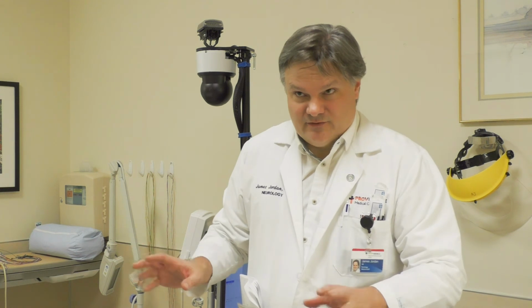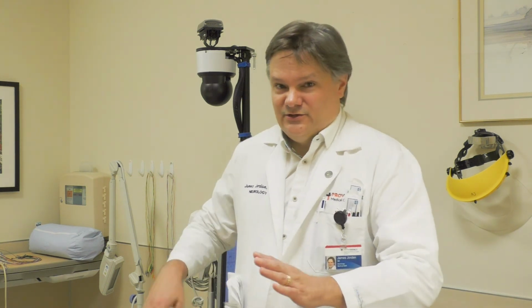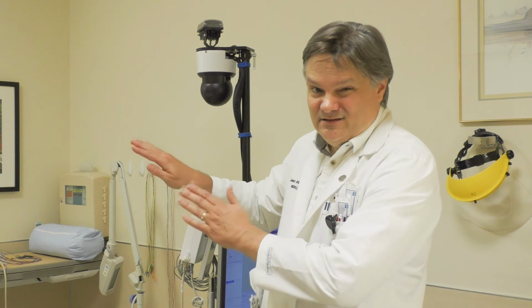And then it's time for the post-seizure assessment once your seizure is over. Again, always staying away from the camera, always saying everything out loud. First thing you're going to want to do is probably turn off the seizure alarm. It's probably driving you crazy. You do that behind the bed. There should be a silver and a white plate that you would push to turn it off.